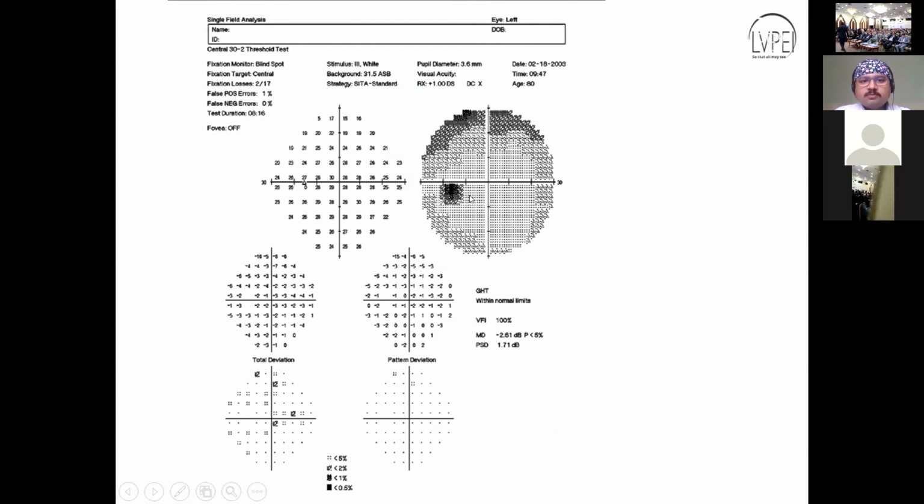Now here the point to be concentrated on is this. We see that there is a gray zone, which is seen prominently in prominent brows or ptosis. In such cases, we should tape the brow or tape the eyelid to get a better result.